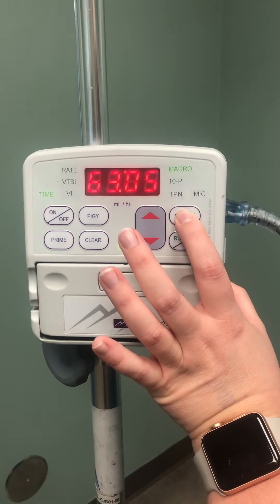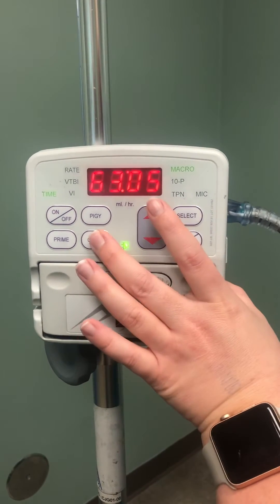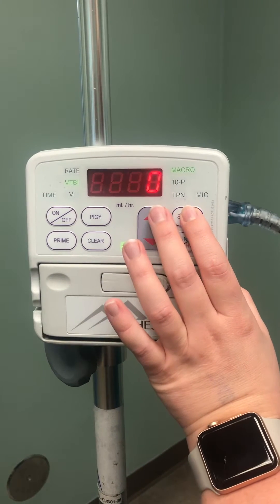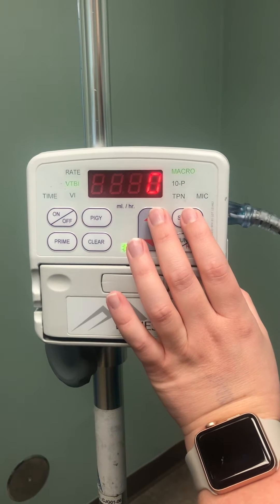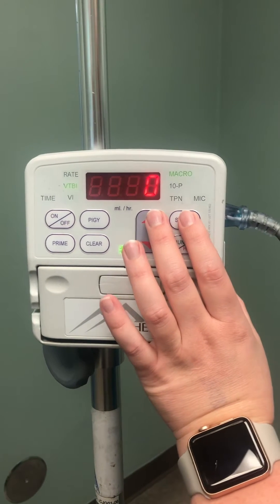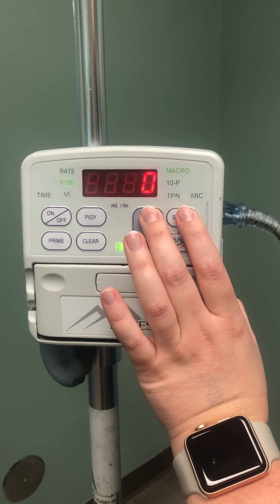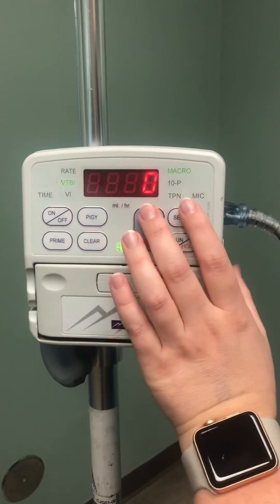It's going to show you the time that this machine has been running, so you can clear that. Hit select again. You have your volume to be infused — this one is really important if you are only needing to give a certain amount of fluids over a certain amount of time. A lot of times for our surgeries, we will just put this up to 1,000.